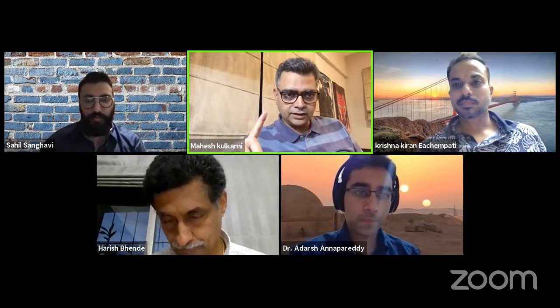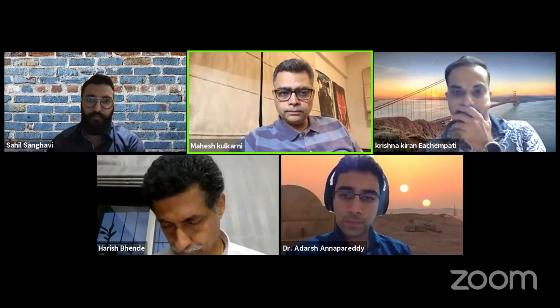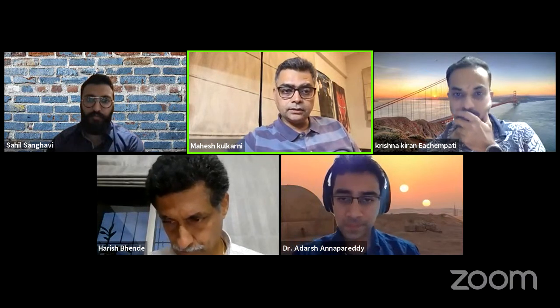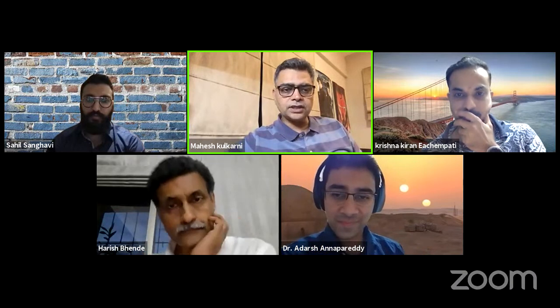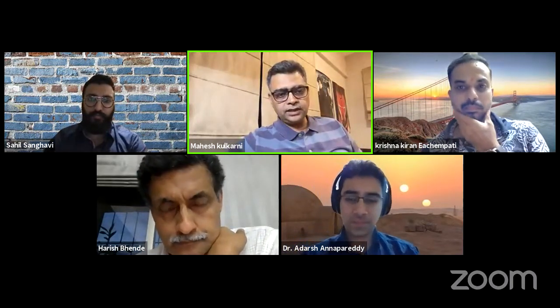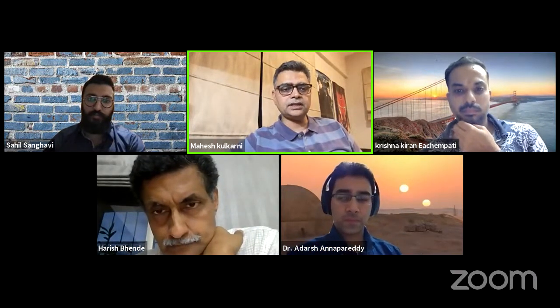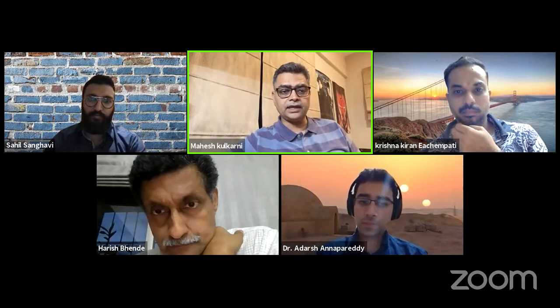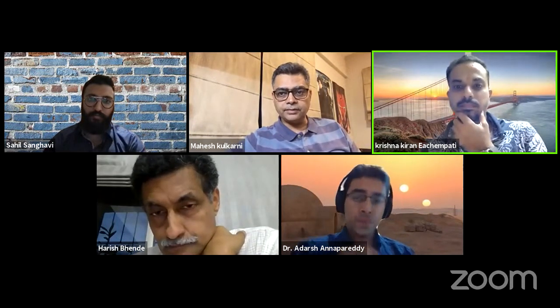Sorry, Sahil, I just want to make a comment. I have seen the Mako 4.0. It is outstanding in the sense that it answers some of the questions which were unanswered in my mind. Obviously, you said the navigation will allow you to get the leg length and offset right. Increasingly, patients are being very demanding about leg lengths, and that issue is nearly sorted with this robotics.